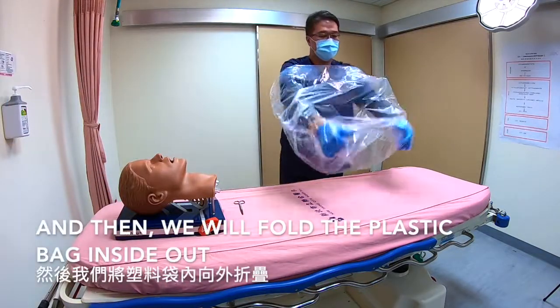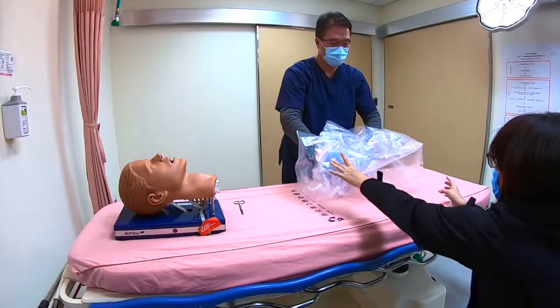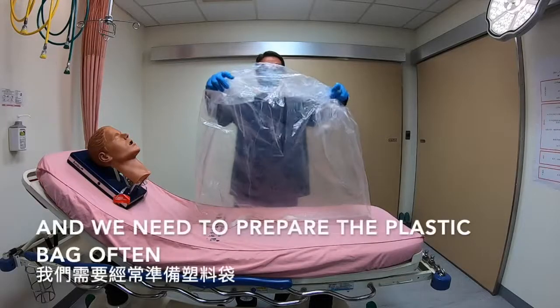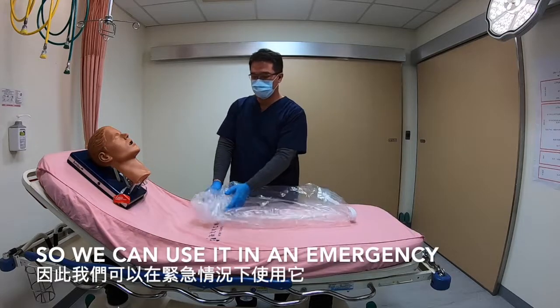Then we'll flip the plastic bag inside out. We need to prepare the plastic bag in advance so we can use it in emergencies.